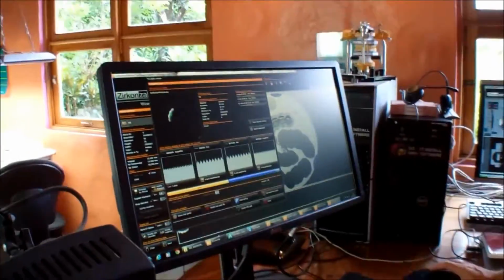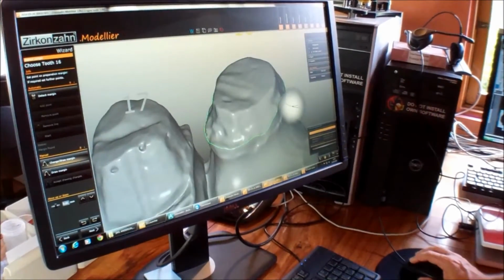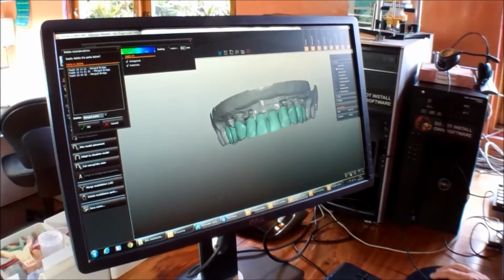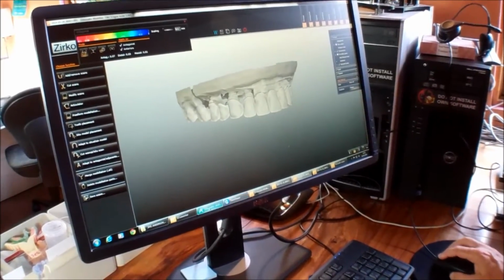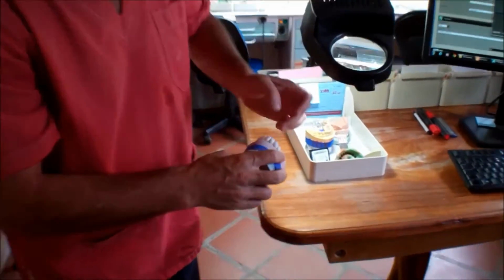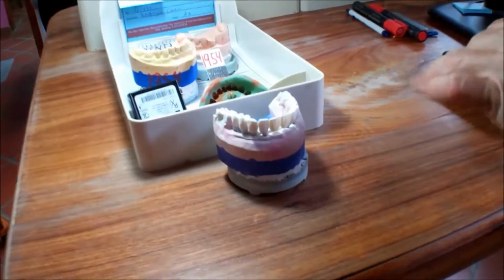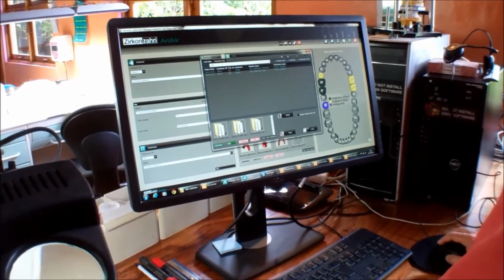So let's see here. Okay, so this is you. This is one of your bridges. Oh, that's one of my bridges there. Yeah, this is the front one. So now we go. This is another work. This is you. Okay. Those are my three bridges there. Yeah, but this is prepared to accept porcelain in the vestibular. Okay, I show you. Let me see what number you are. Okay, this is you here. It's the provisional, but with a kind of special material you cover on the top with a spray because to take a scan, we scan that one. Yeah, this is you.